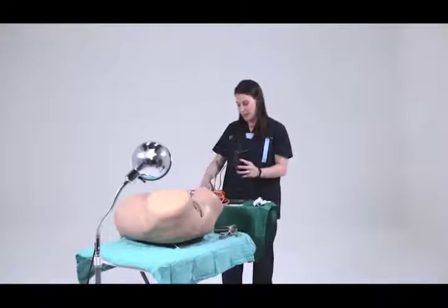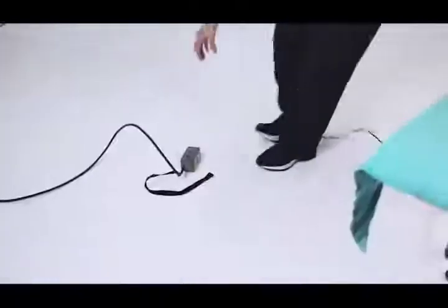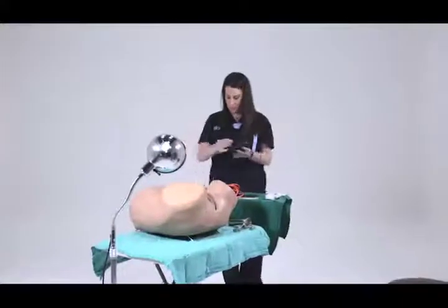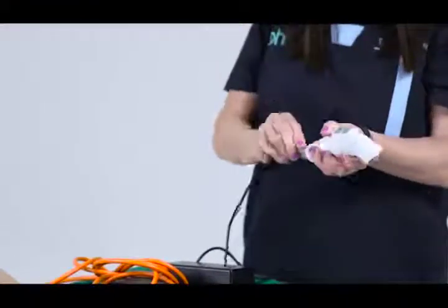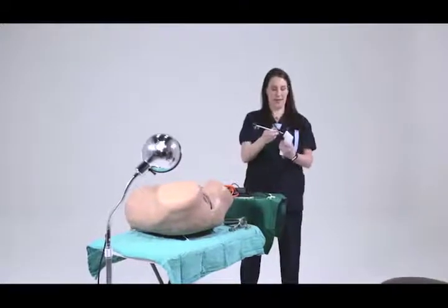If you have a site with electricity, all you have to do is plug in the device. There are two places to plug it in, here and here on to your device. You'll hear a little click.